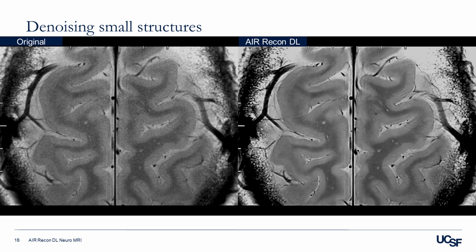Here, yet another example. This is not hippocampus, obviously, but highlighting the improvement of these small anatomy, the improvement in sharpness of the small anatomy here up near the vertex of the brain, where we see sharper delineation both between brain CSF interface around some of the structures within the subarachnoid space, as well as within the brain itself, here between the gray and white matter, for example.